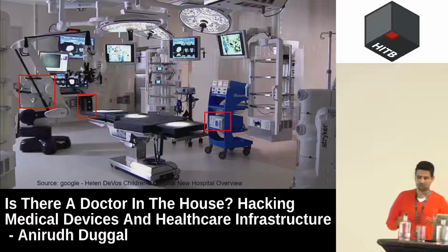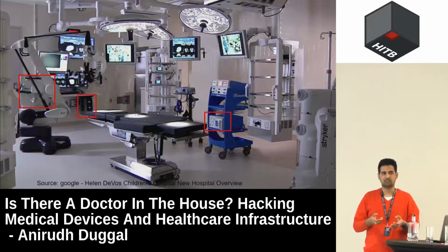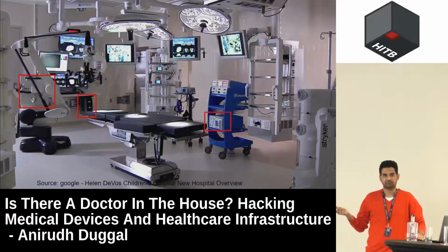So one way of attacking these devices is attacking the OS. Like if you have vulnerabilities with Windows XP, Windows 7, the FTP server as such, you can attack them. And I would say that these are more like system security that you would be doing.